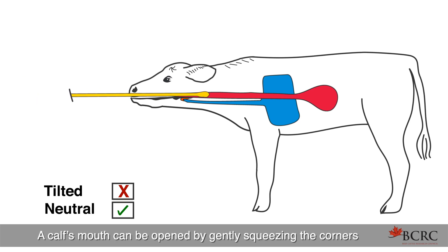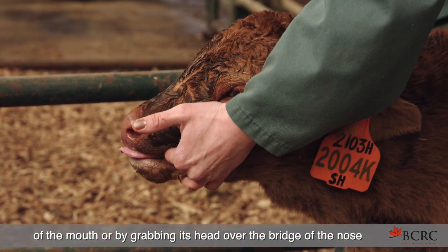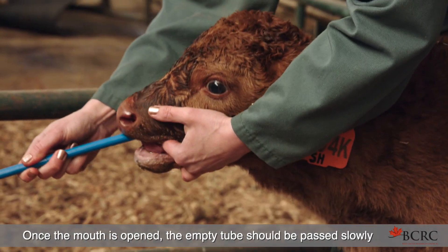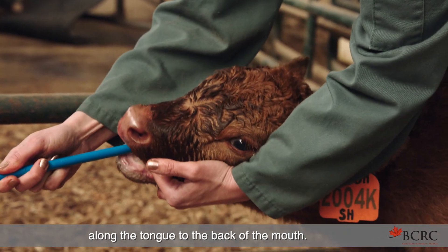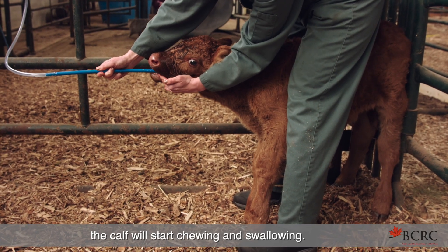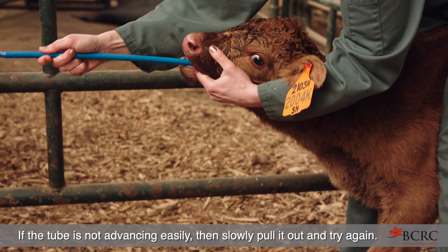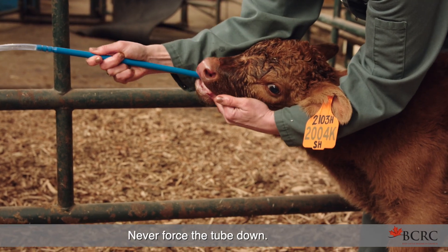A calf's mouth can be opened by gently squeezing the corners of the mouth, or by grabbing its head over the bridge of the nose and putting slight pressure on the upper palate or gums. Once the mouth is opened, the empty tube should be passed slowly along the tongue to the back of the mouth. Once the tube reaches the back of the tongue, the calf will start chewing and swallowing, at which point the tube is passed down into the esophagus. If the tube is not advancing easily, slowly pull it out and try again. Never force the tube down.